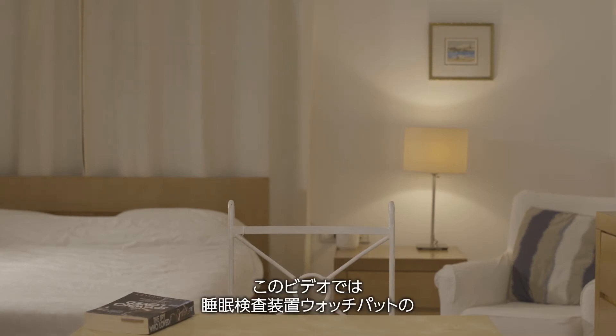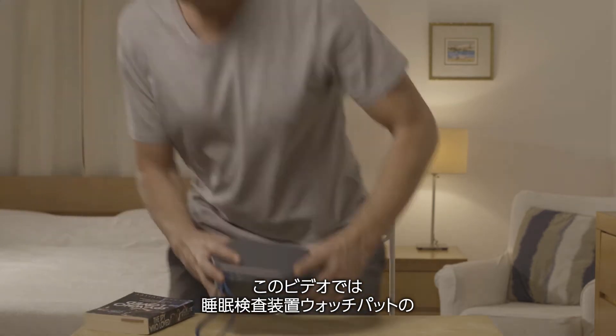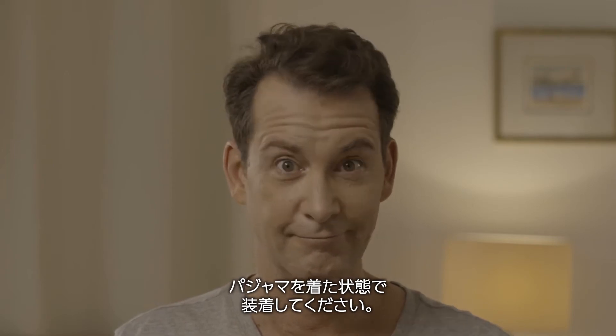This brief video will show you how to correctly put on and use the WatchPAD home sleep testing device. You should put the WatchPAD device on when you are already in your pajamas, just before getting into bed.